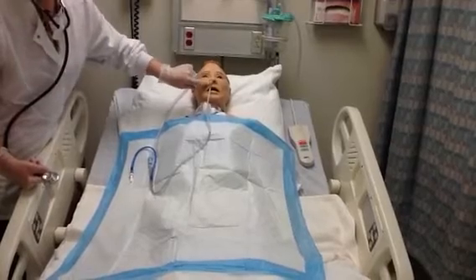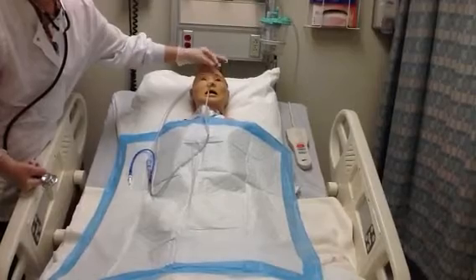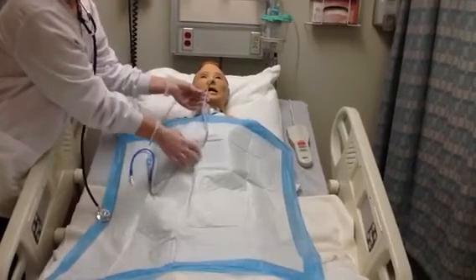I'm looking at the nare to look for any skin breakdown. I'm also making sure that the tape holding the NG tube in is intact and holding it down. I'm also looking at the markings on the NG tube.